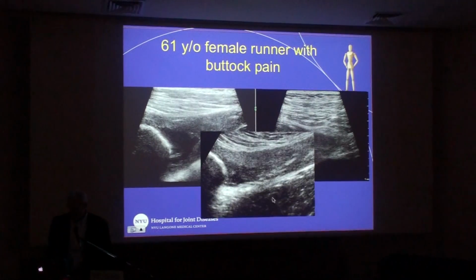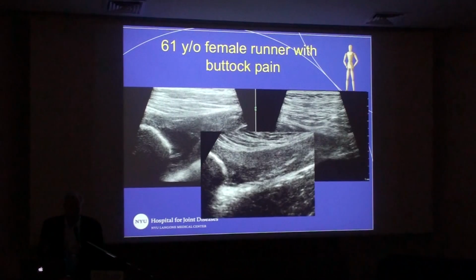Anyway, this is her 3 months later, and you can notice that this is her tear over here. Initially, this is what it looked like, and 3 months after doing the PRP injection, she actually had a very nice response. And hamstring is actually one of the places where we've seen fairly good response, and we recently completed a double-blind study using just simply autologous blood, and these patients do considerably better in the PRP cohort. So we know that there's some efficacy for doing these types of procedures.